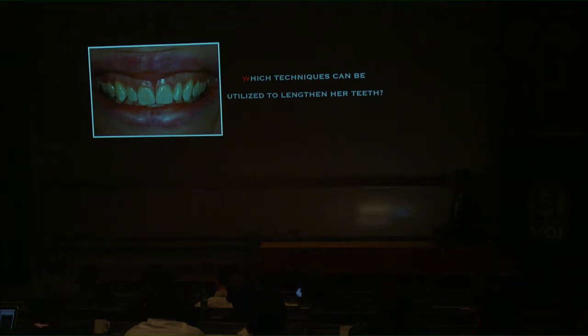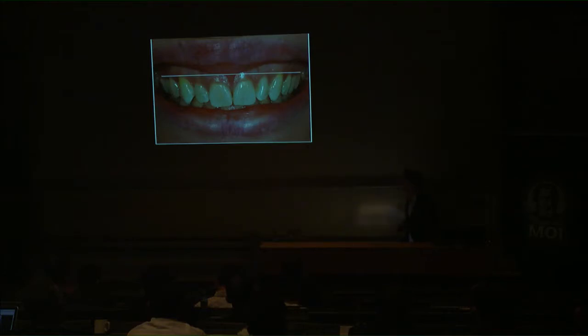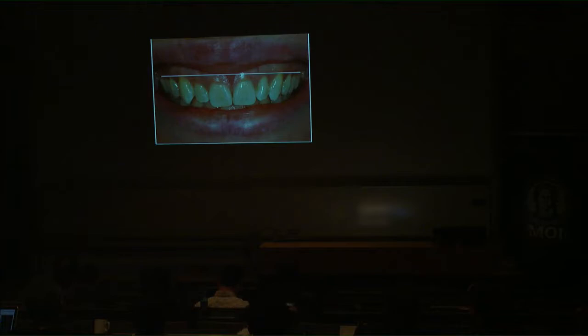So the technique I'm going to talk about today, I'm going to describe a little bit later. So this is the line for the smile design. We would like to reduce soft tissue on both centrals and also tooth number 12. So at the end of treatment, we will have a smile zenith line looking like this, with the laterals just a little bit shorter than the centrals and the canines.